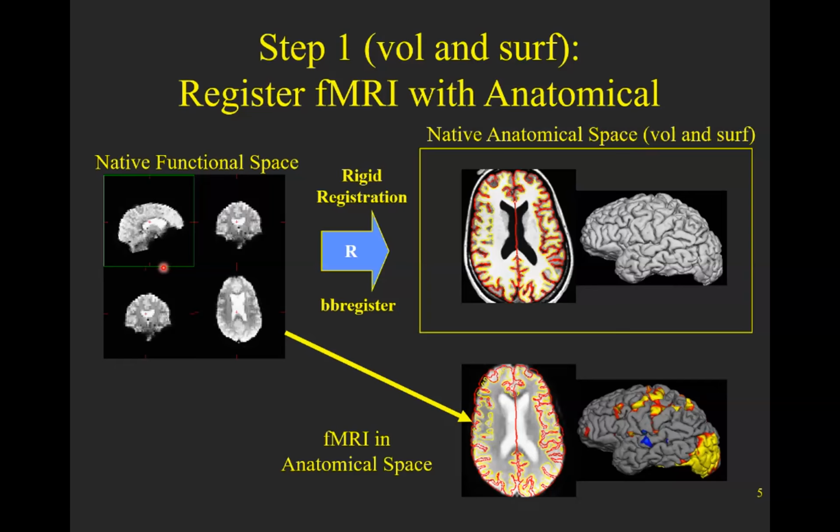You can do this, which is maybe, I suppose. And so the basic idea with registration is that you would take the fMRI and apply some transform to it that would be some indication of what these 6 parameters are. And then you would overlay it on the anatomical, and you sit there and play with those things until you get the best alignment in some way.